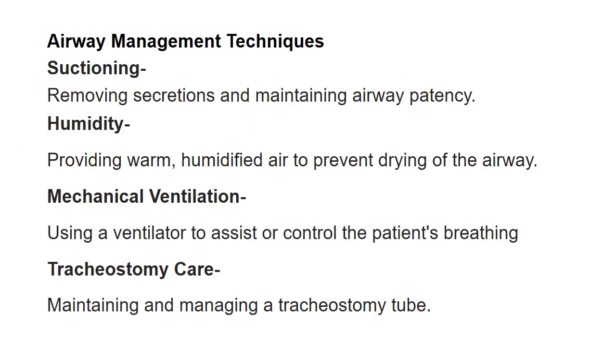Next, airway management techniques. How to manage it? Do suction regularly when it is required, and maintain airway patency. Humidity: always use a humidifier. Don't give dry air to the patients, because this will cause blocking of the endotracheal tube or blocking of the tracheostomy tube. So always give humidified air to the patient.